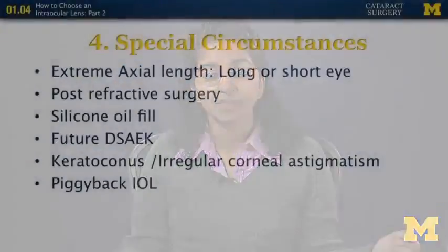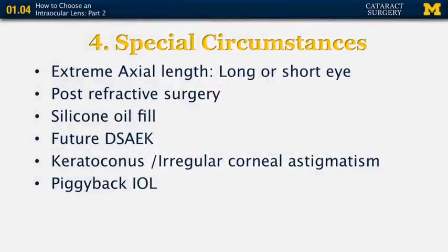These sorts of pieces of information help us to also guide the operative eye because some patients do notice a difference in color of IOL selection between the two eyes. Or if we do know that we did not hit our target in the first eye, and we do see that there was a good bit of error, we can use that amount of error to adjust for the calculation in our next eye.